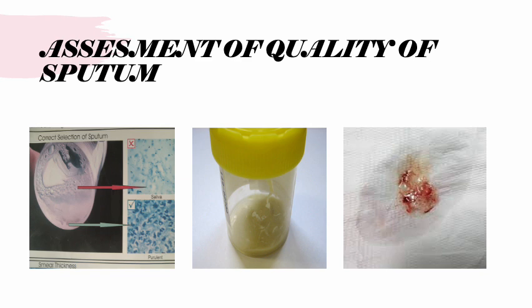On the other hand, the one in the center would be the preferred one. As you can see here physically, there is an adequate amount of the representative sample. Usually the right physical state of the sputum should be a yellowish or greenish sample.